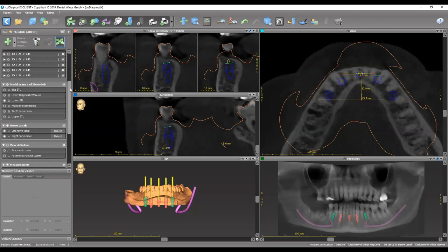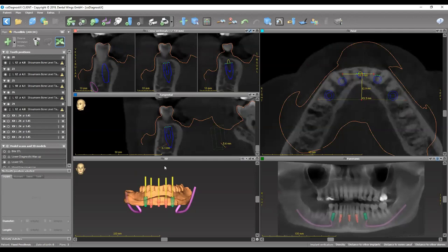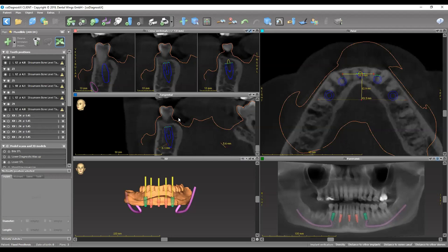Once we're done, we place fixation pins between the implants at a 45-degree angle, place the sleeves on top of the implants, and then process the guide. The only difference with the fixed prosthesis plan for a patient who is still dentulous is that you need bone reduction done. Most cases won't have too much vertical bone loss, so there's still bone above the implant platforms since you're placing them deeper to achieve 15 to 17 millimeters of vertical clearance — you need to shave that bone off. For completely edentulous patients, they usually have some vertical bone loss from wearing dentures, so not as much bone reduction is needed.